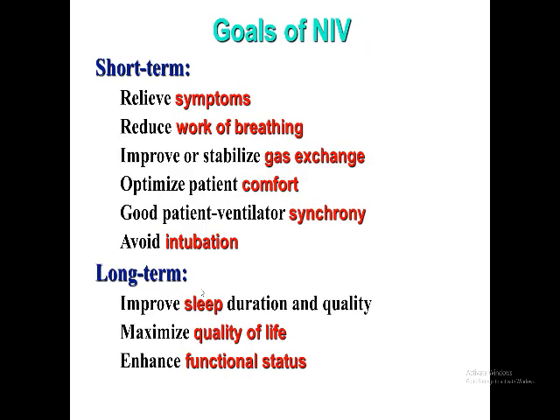The goals of non-invasive ventilation: short term and long term. Short term: relieve symptoms, reduce work of breathing, improve or stabilize gas exchange, optimize patient comfort, good patient-ventilator synchrony, and avoid intubation. Long term: improve sleep, maximize quality of life, and enhance functional status.